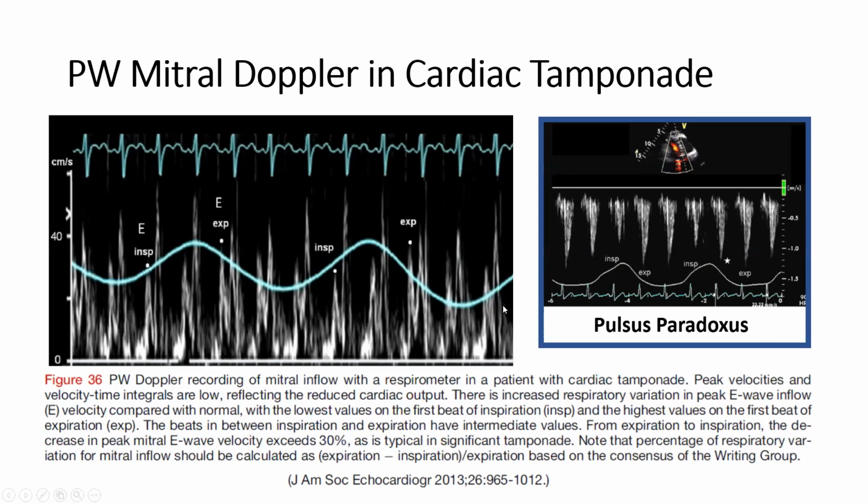It's not always available. Sometimes these patients are so sick that they move, or the contact with the chest is not as good, the marker is not as good. So you don't always get to deliver this. There is always a reality that comes in the way, okay?